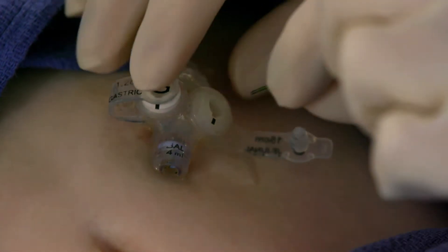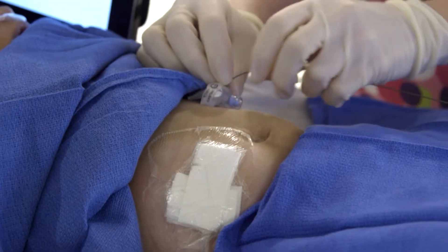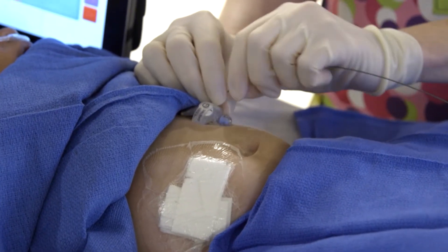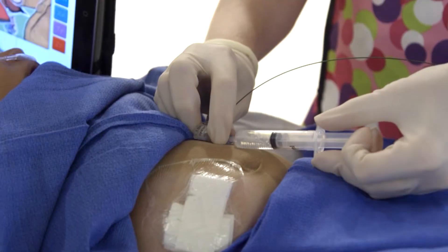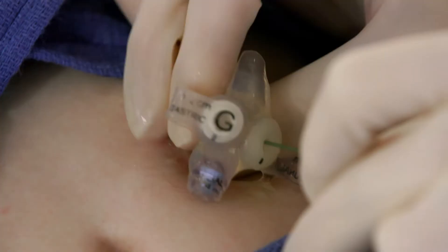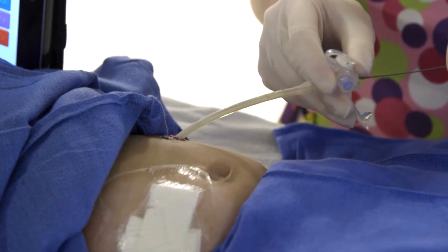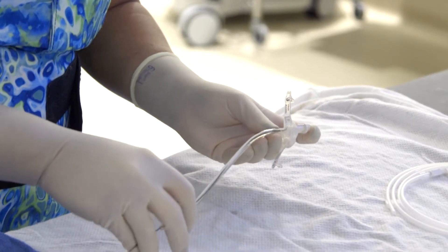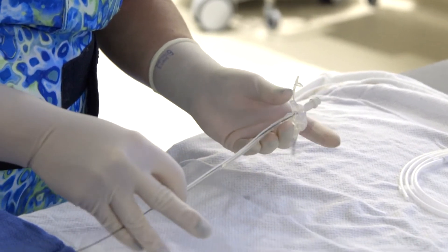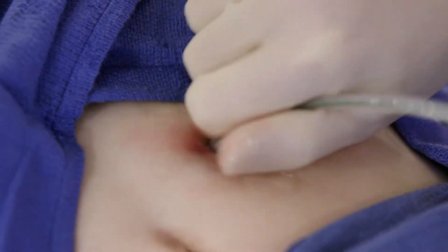Otherwise, you can just go through that jejunostomy port with a guide wire. Once you get the guide wire out about a few centimeters past the tip of the tube, then you can deflate the balloon. Then, while keeping the guide wire in place, you're going to pull the tube back off of the guide wire. Once that's done, you've got your position held with the guide wire, then all you have to do is slide the new pre-lubricated tube over the end of the wire.